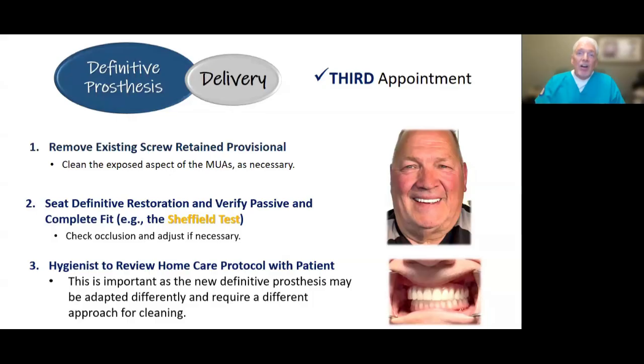For people that maybe have arthritic issues or poor vision, it may be something you have to work out with them, because again, home care is critical for the long term of these, and the patients need to be committed to that. But just because they did a great job on their provisional, don't think they're going to know how to address and take care of this definitive prosthesis, because again, it is going to fit differently. So there may need to be something done differently for that. So allow time for that.